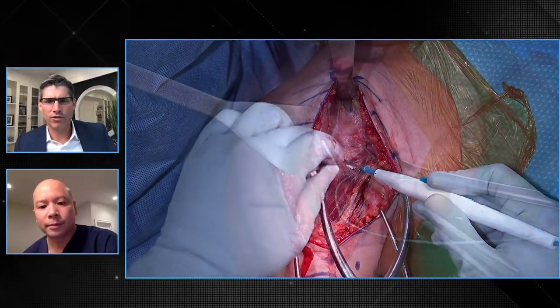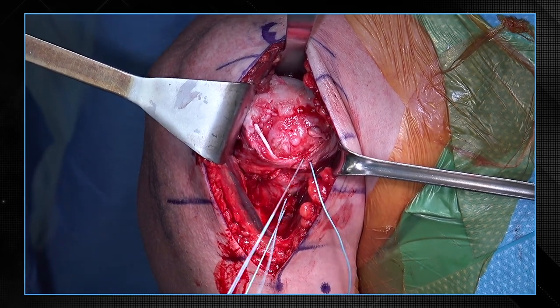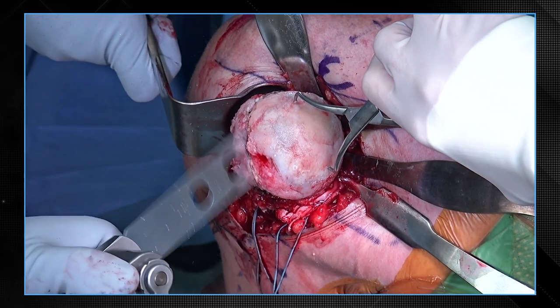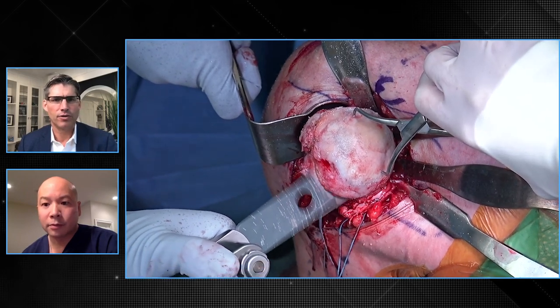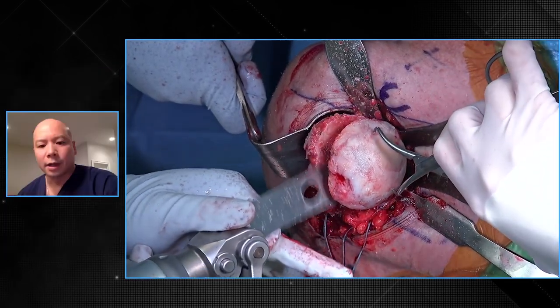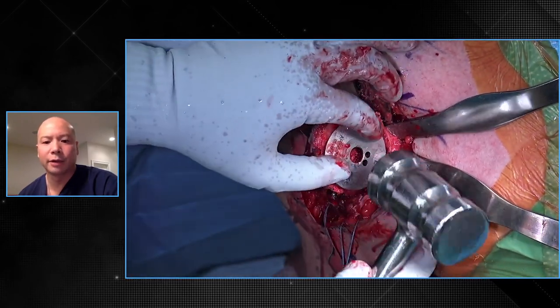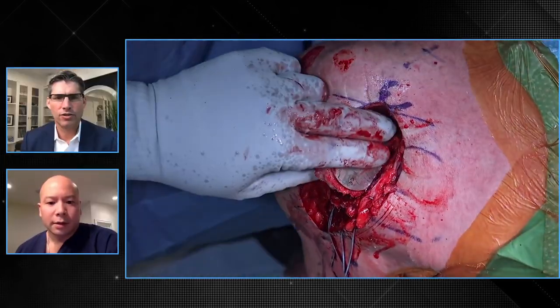So it looks like you're doing a deltopectoral approach here. He doesn't really have any rotator cuff left — not surprising given the MRI. He's pretty deficient. His subscap is pretty deficient, so we just tag whatever we can, including the capsule. We've got the humeral exposure here, and I like to do just a freehand cut right at the anatomic neck. And you do that at 135 or 155? My choice is 135 — I think it matches the anatomy a lot better. I do this freehand, though you can use an intramedullary or extramedullary guide to also preset or pre-cut at 135 or 155. In most instances, I will try for a 135.